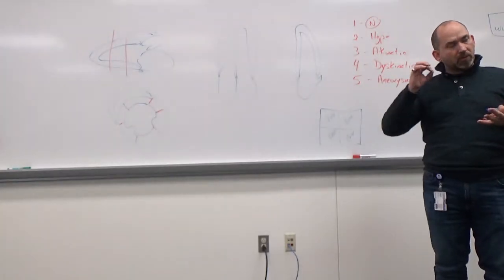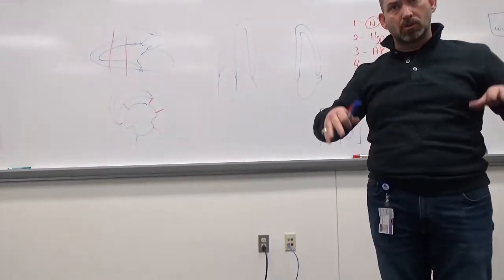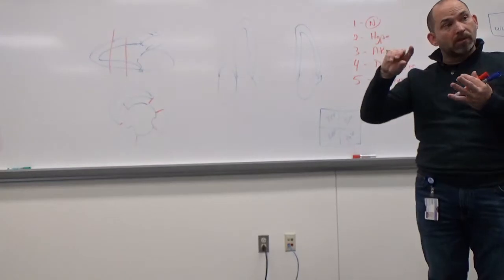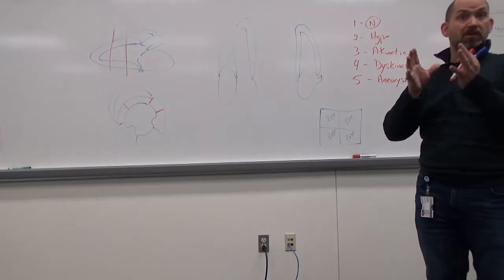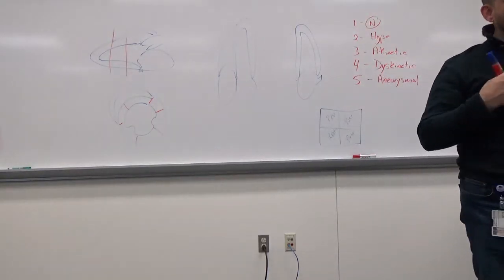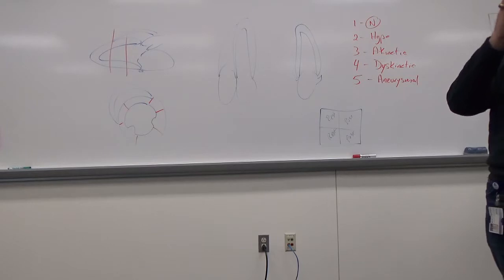So these bubbles actually pass through it. These are less than 5 microns in size, so they pass right through your capillary supply, and easily go through the left and right side of the heart. We have to decrease our power outputs on the system, so it's actually a very dark image, because when the bubbles come up and light it up, these are very intense reflections that we're getting off the ultrasound beam. So it will light up so well. Now, if I've got a strongly shadowing rib or something going across my image, that shadow is still going to be there. So it's not perfect, but it can often enhance little areas where you just can't quite see the definition.